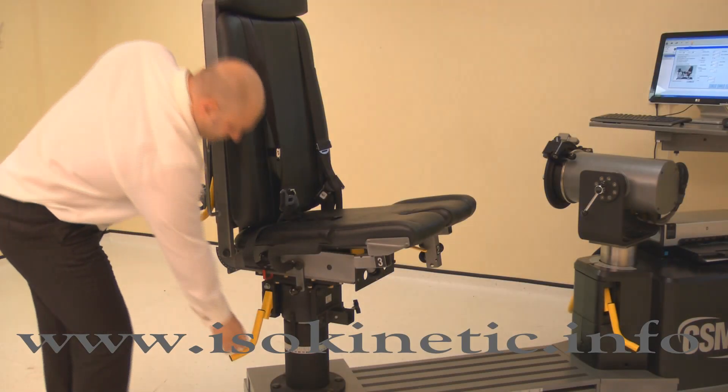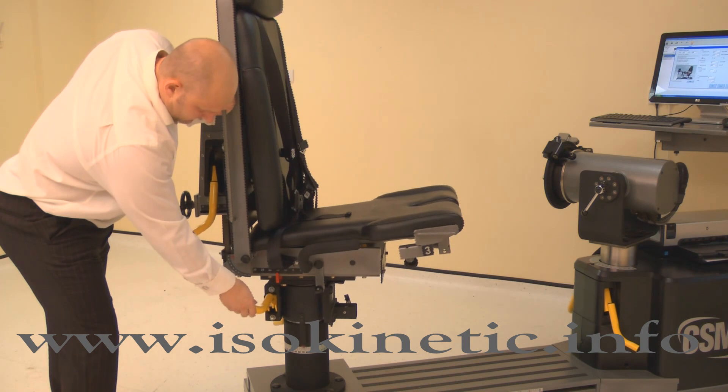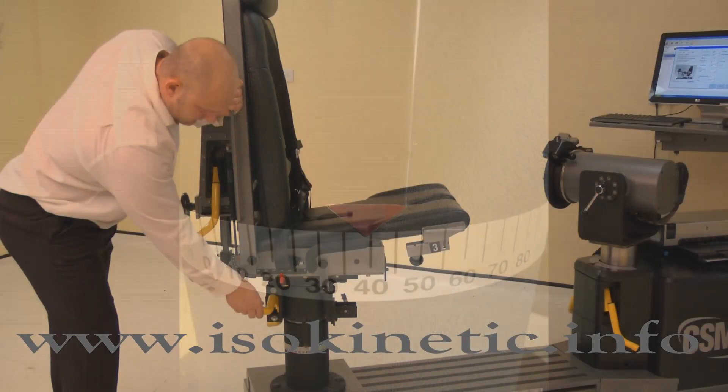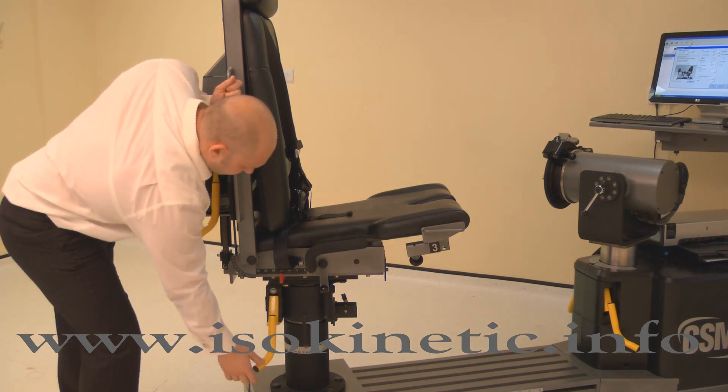Now adjust the chair rotation. Lift the locking handle and rotate the chair. For the left knee, rotate the chair to 40 degrees on the black scale. Ensure both locking handles are pushed down to secure.